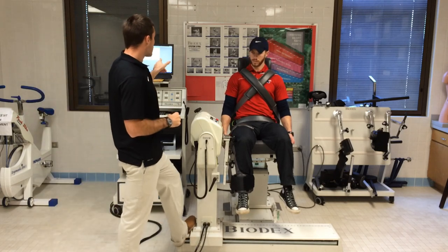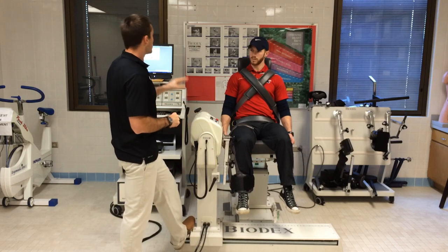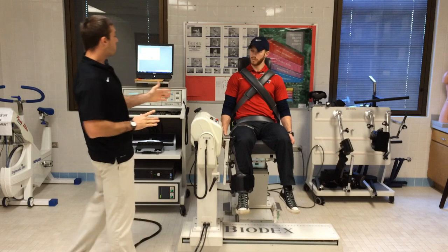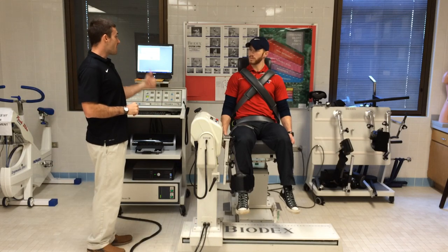So what I'm gonna do is when I hit go, I'll tell you to give me one at 50, one at 75, and then one at full range, just getting used to it, okay? After you've done those three, I want you to pull the leg all the way back and hold it. That's gonna be your starting position, okay?